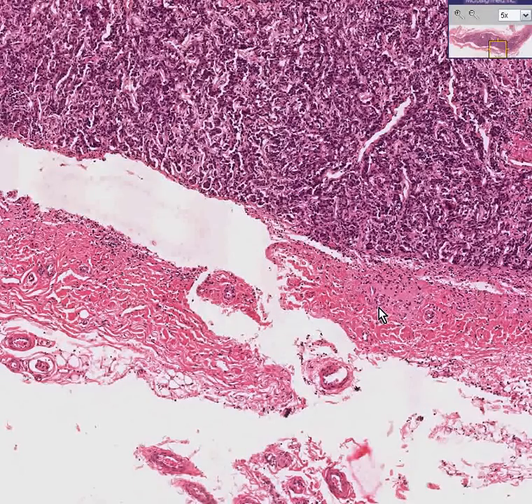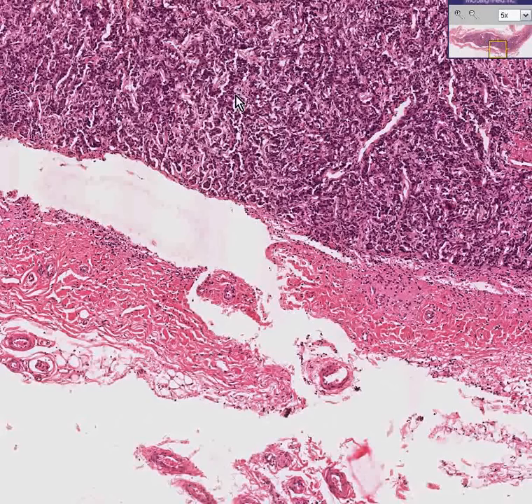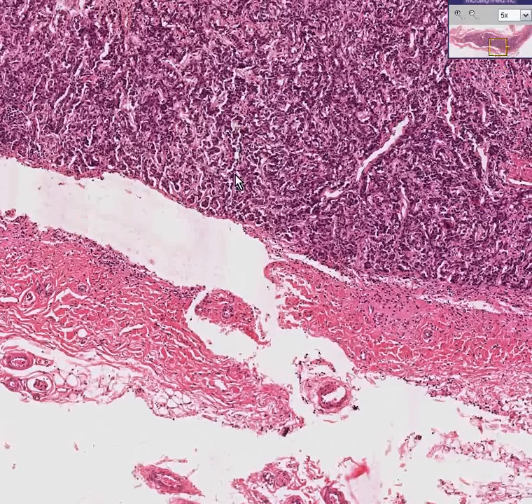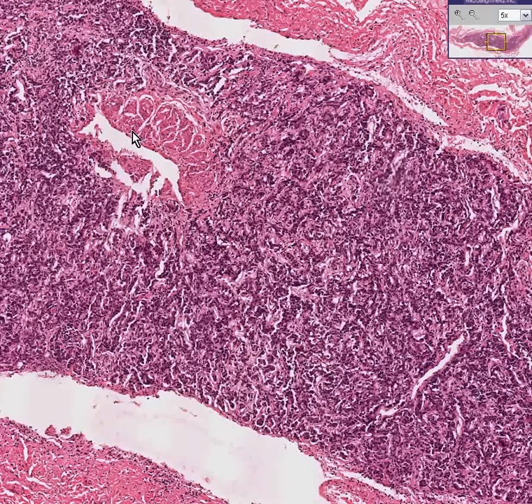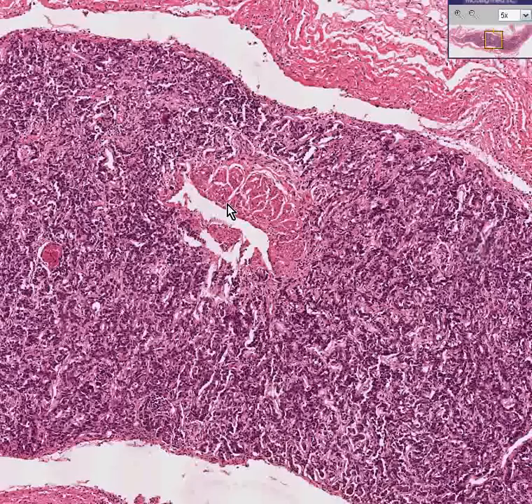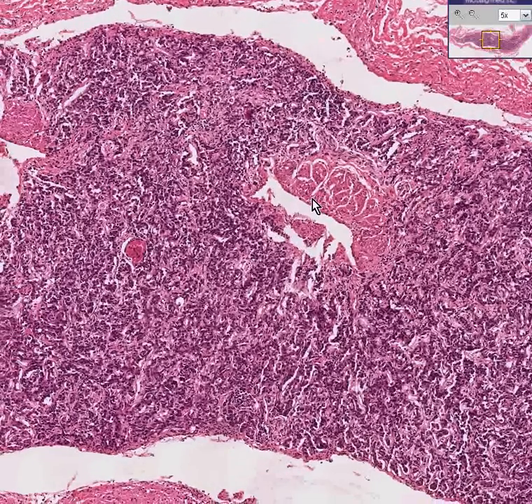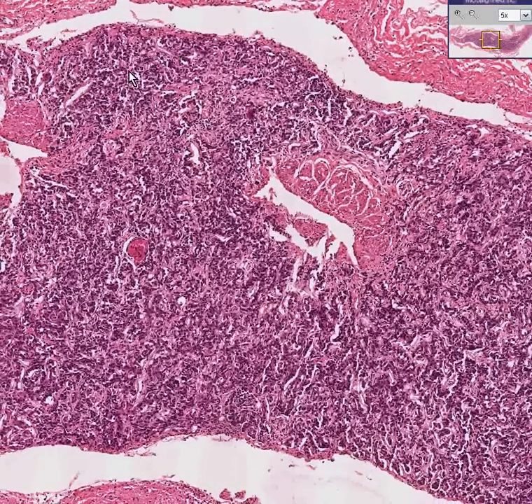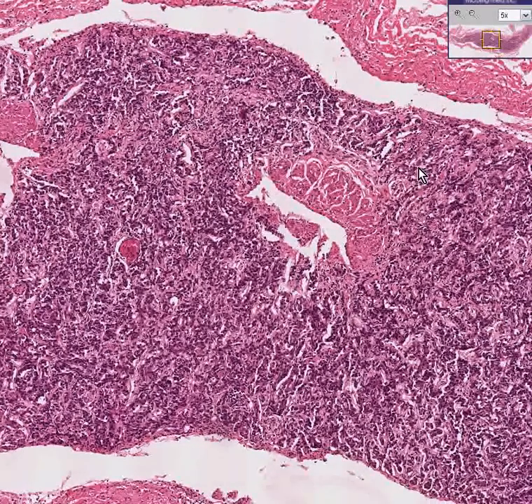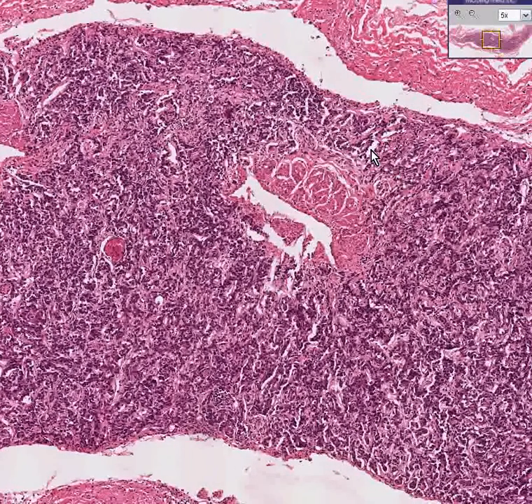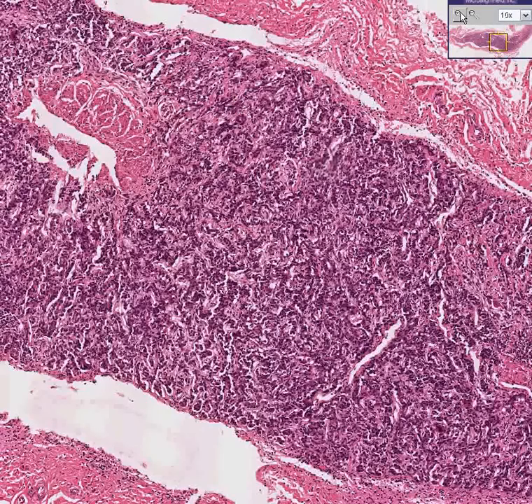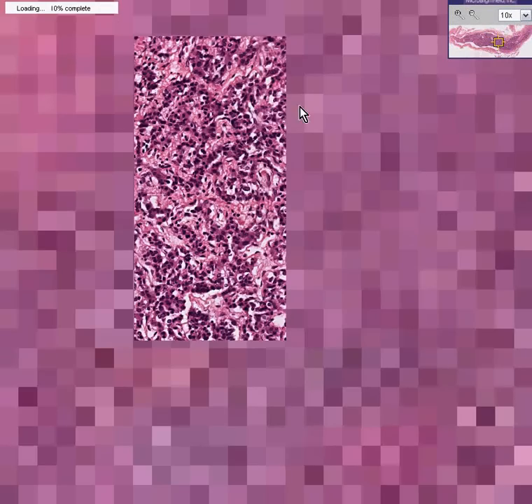Sure, you could see a capsule. Sure, you could see some fat surrounding the capsule. Sure, you could see some centrally located large veins. But in all honesty, you really don't see too much by way of cortical epithelial differentiation.